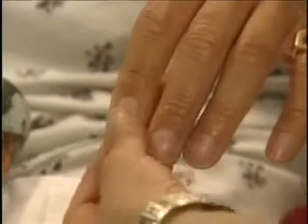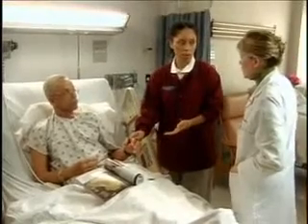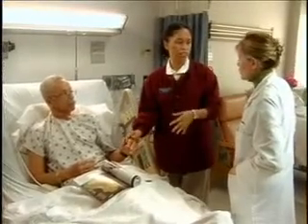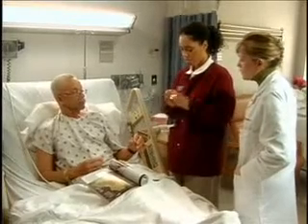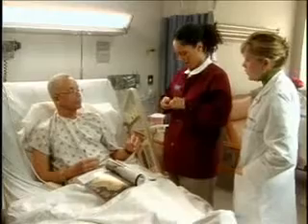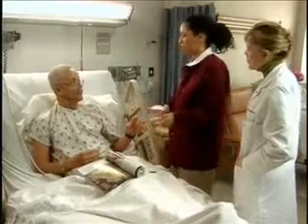What if the circulation is inadequate? Then I could use his earlobe or the bridge of his nose, providing I had the right sensor for the sites. Or you may use his toes, providing the circulation isn't compromised. All right. So now I'm going to cleanse the area with an alcohol wipe to prepare the site. And you don't have any nail polish on, so... Not today. But would that matter? Yeah, it could interfere with the measurement, yes, and we want the results to be exact.